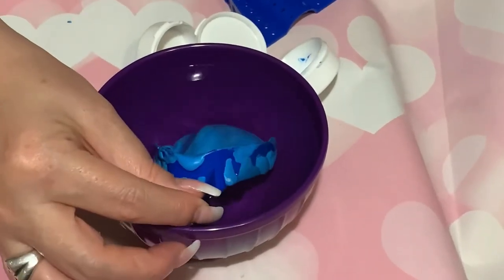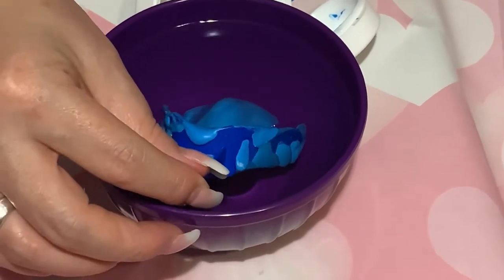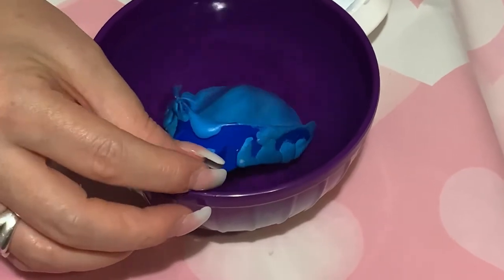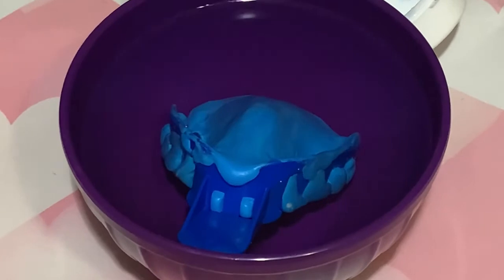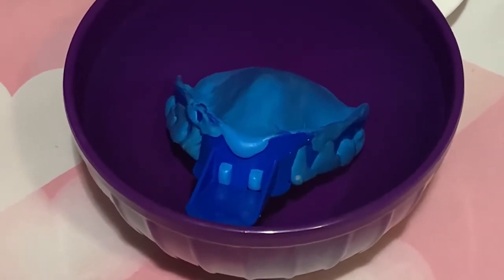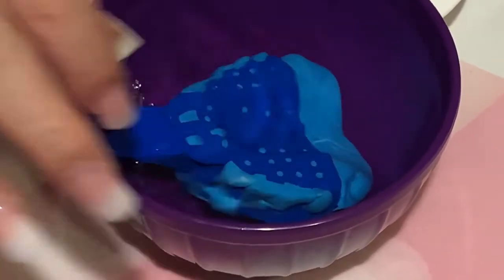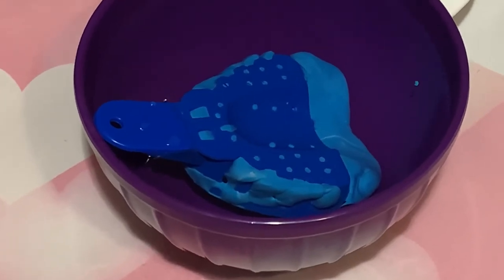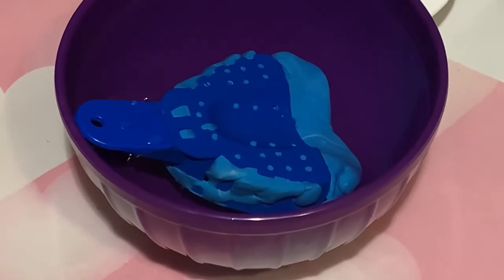Now we're going to place it in the water, in cold water. Now it doesn't say on here how long, it just says to ensure the set. So I'm going to leave it a little bit, maybe for about a minute, just to make sure. Better safe than sorry, right?